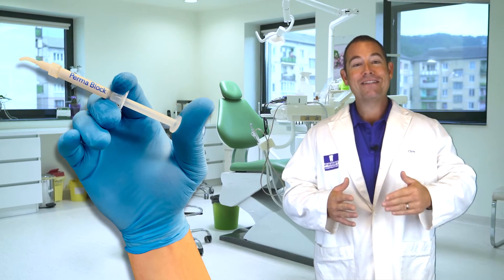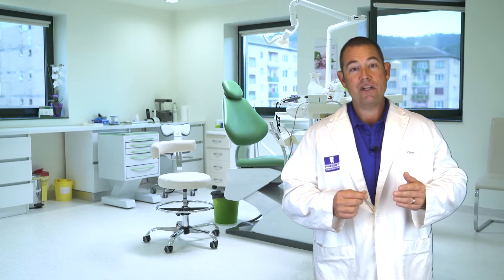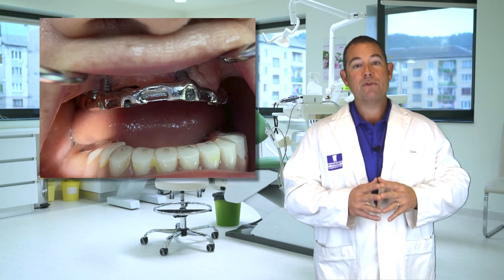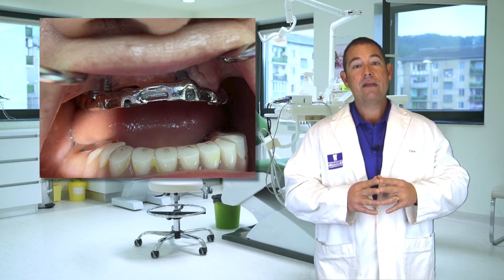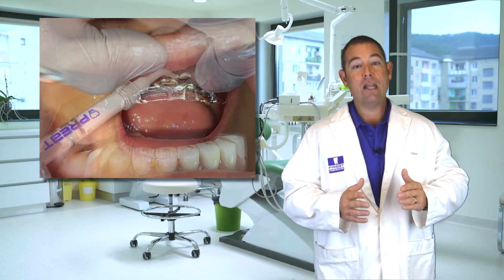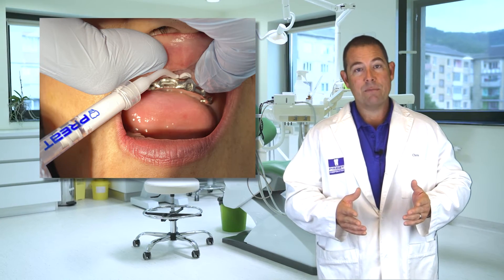So the patient presented and the fractured bar was removed, sectioned off — it really was only the distal cantilever that had broken off, so the implant was covered. The next step was to use the syringe of Permablock to block out this large undercut between the bottom of the bar and the tissue, to eliminate locking in the prosthesis during our chair-side pickup of the prosthetic components.